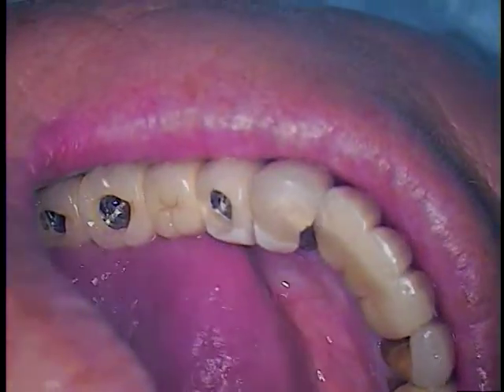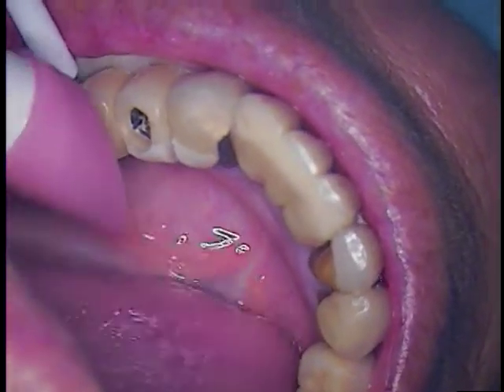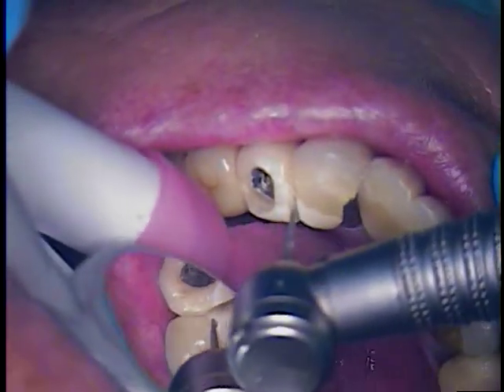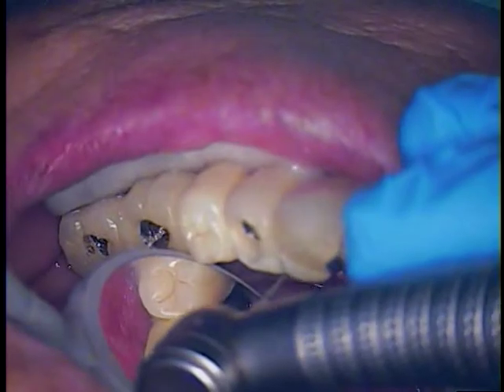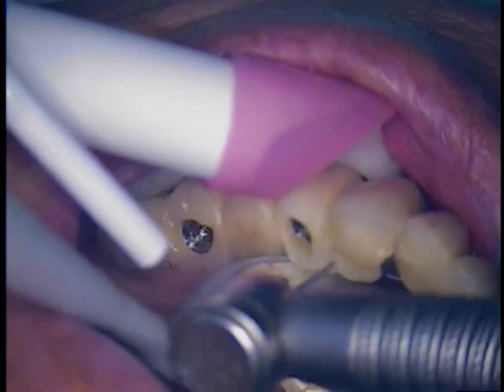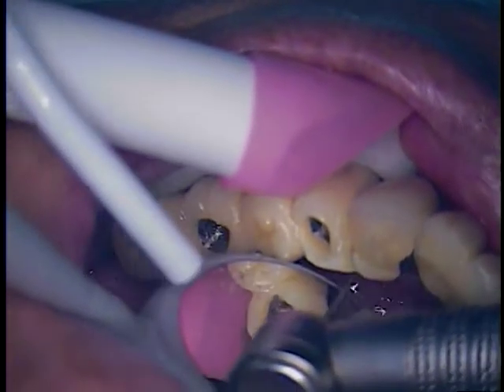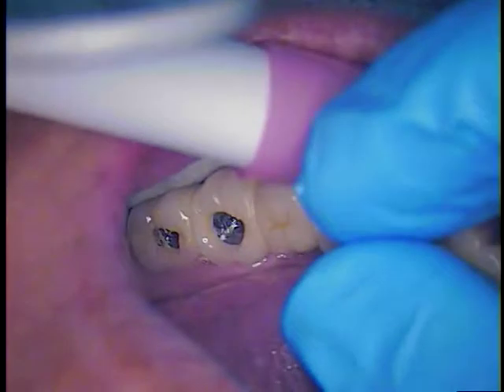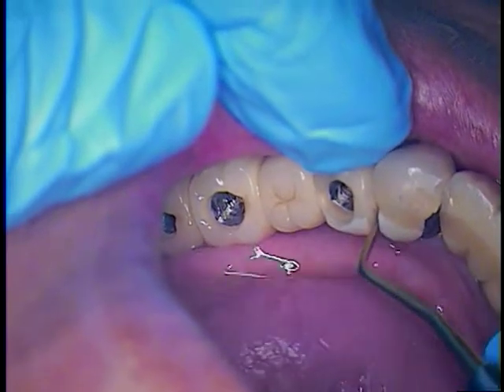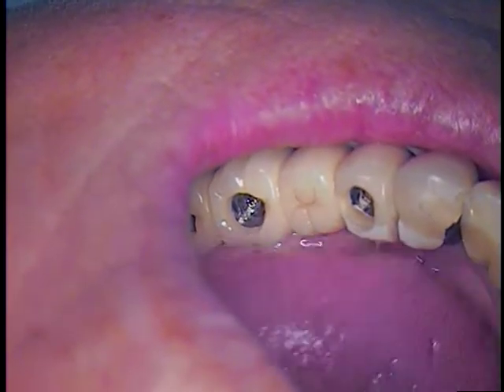Now what we're going to do is try to lift this bridge off. I might have to relieve a little more of that bonding, so I'm going to do that now with a fine diamond. I'll sneak in here. This is just our old bonding that we placed in between. I'll take our driver and see if it does come.